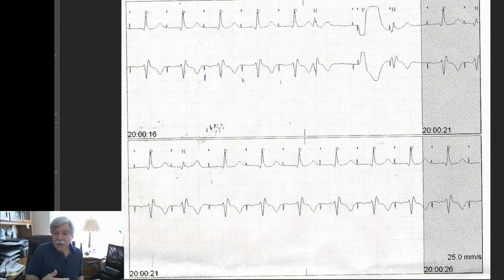So some elderly patients who don't move around much, you can make them more sensitive so that when they do walk to the bathroom, their heart rate will go up more. But a young person who's out on the tennis court, right, with sick sinus syndrome, they're going to be much more vigorously working, and they're going to be generating a lot more vibration, a lot more motion. The accelerometer is going to go crazy. So you can dial down the sensitivity in those patients and get it to restore a more normal heart rate. In fact, in younger patients, we generally will program the upper sensor rate at like 140 so that they can get up to higher heart rates and improve their cardiac output and feel more normal.